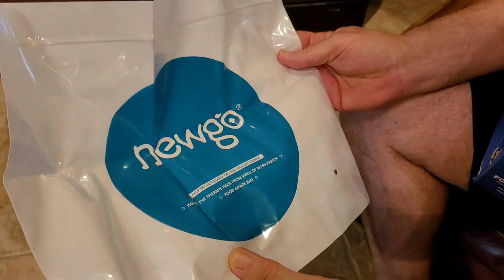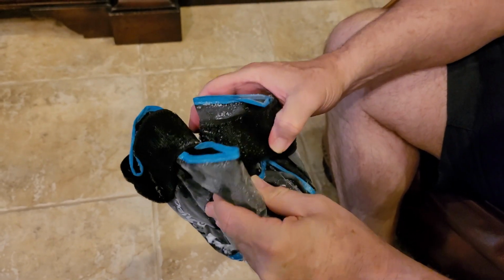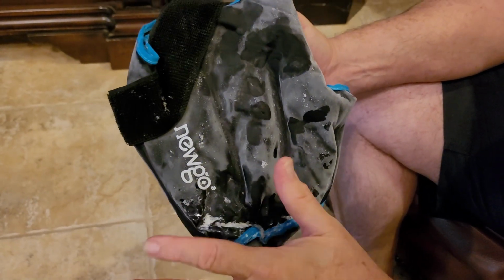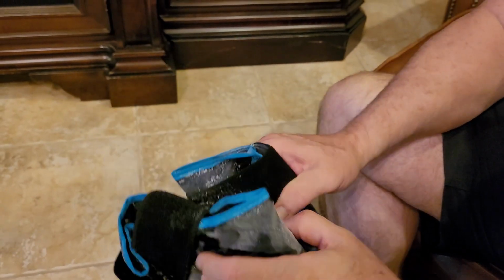Freeze it. I'm just using a clear kitchen bag, and I just pulled this out of the freezer. That's what it looks like. When you pull it out, you want to let it sit. It said, I don't want to say thaw out, but wait about a minute so that it doesn't crack.